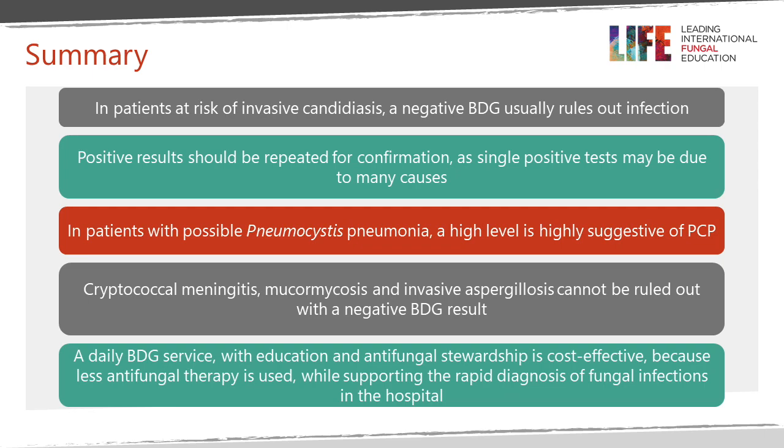In cryptococcal meningitis, mucormycosis, and invasive aspergillosis, a negative BDG cannot rule out the infection. Although it does make it less likely, it isn't good enough to exclude infection on that basis. And if a daily BDG service can be run, associated with education of clinicians and antifungal stewardship, then quite a lot of savings can be made and a more focused antifungal therapy given to the patients who really need it. And that service can then support the rapid diagnosis of fungal infections across the whole hospital.